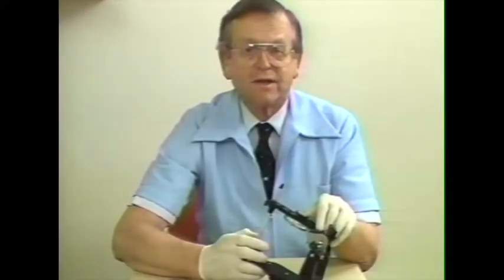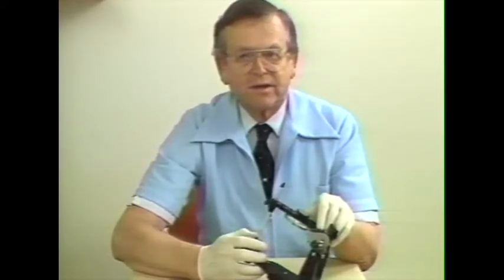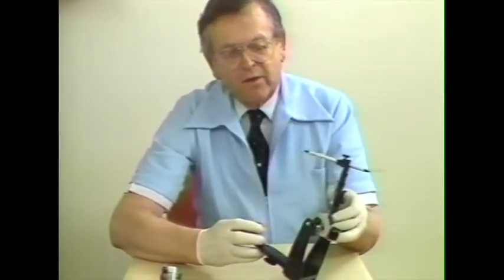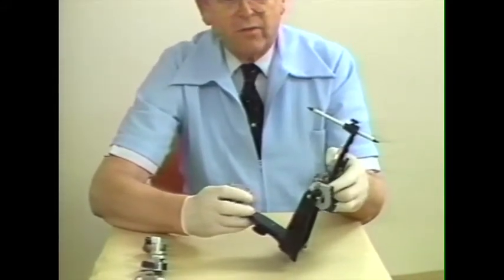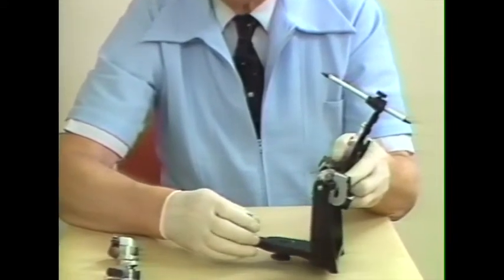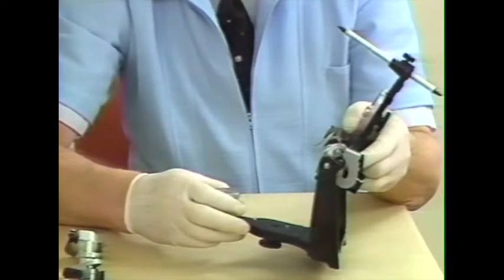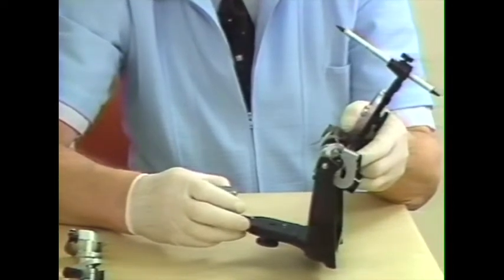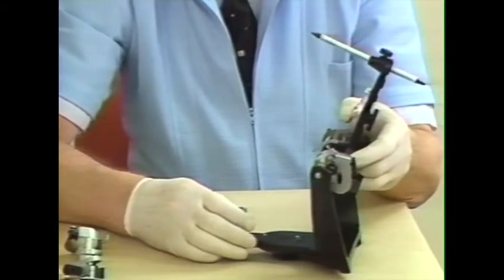Hanau Modular Articulator has a number of features which allow the clinician to select the type of articulator he desires. First, it is an Arcon articulator, which means that the condylar elements are on the mandibular arch and the fossae elements are on the maxillary. This more closely duplicates the actual relationship on the patient.